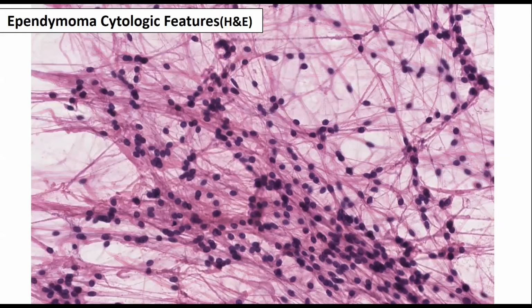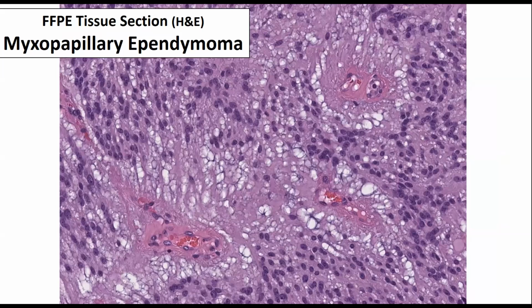Burn this into your brain again. These are ependymoma cytologic features. Can mimic astrocytoma. Be careful if you don't already have the imaging. Now, of course, in our world, we're going to do everything we get to get the imaging or description of it, but it is very useful. Listen, it is very useful to go through these exercises like we're doing right now, starting with the smear, and see how far you can get. That is how you hone, you sharpen your powers of observation and your diagnostic skills, whether it's radiology or pathology.